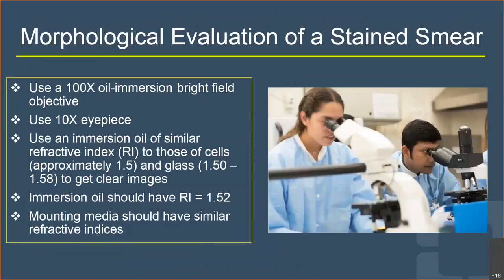Morphological evaluation of a stained smear is done using a 100x oil-immersion bright-field objective. It is important to evaluate all spermatozoa in a high-power field sequentially to avoid any bias or selection of particular spermatozoa. The immersion oil, glass slide, and mounting media all have the same refractive index, which prevents refraction of light and allows correct sperm morphology assessment.